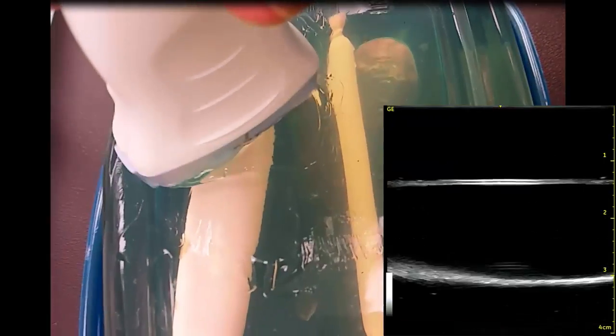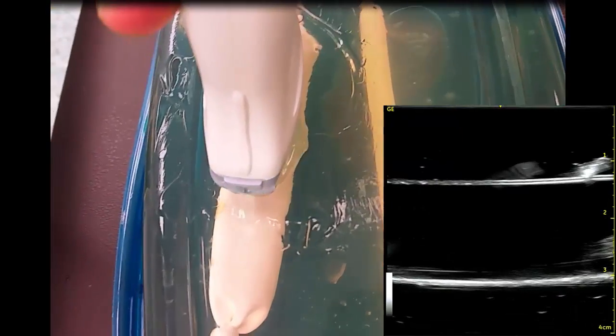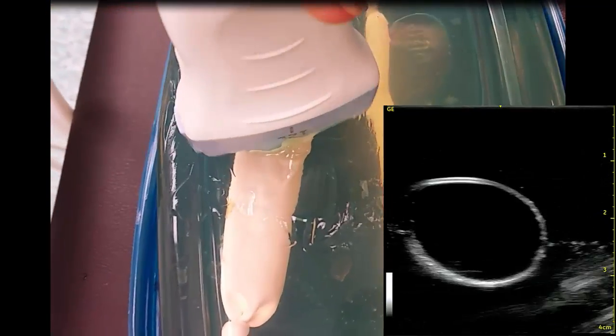So with the transducer on the gel block, I'm going to start off in short axis and then turn it into long axis, and then back into short axis, turn it into long axis, and then back into short axis.